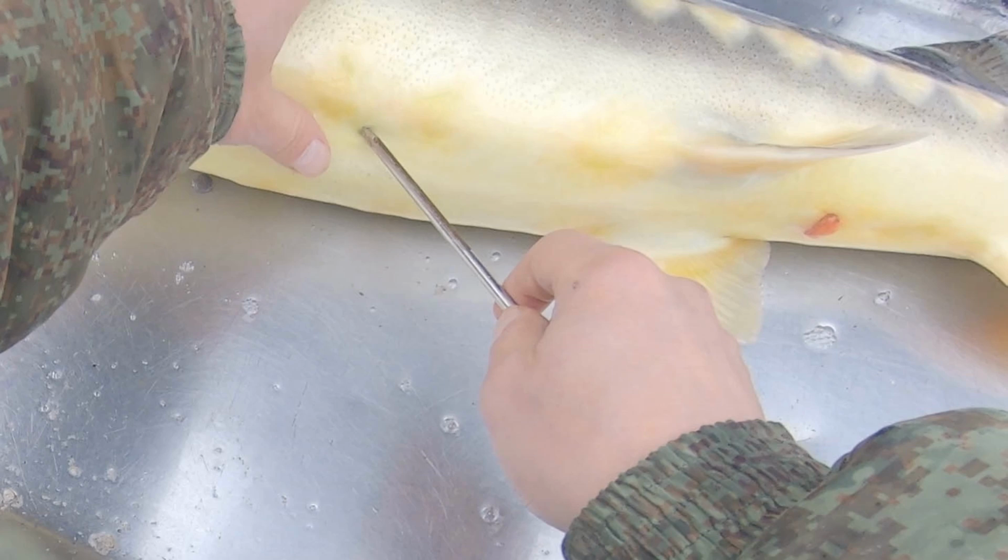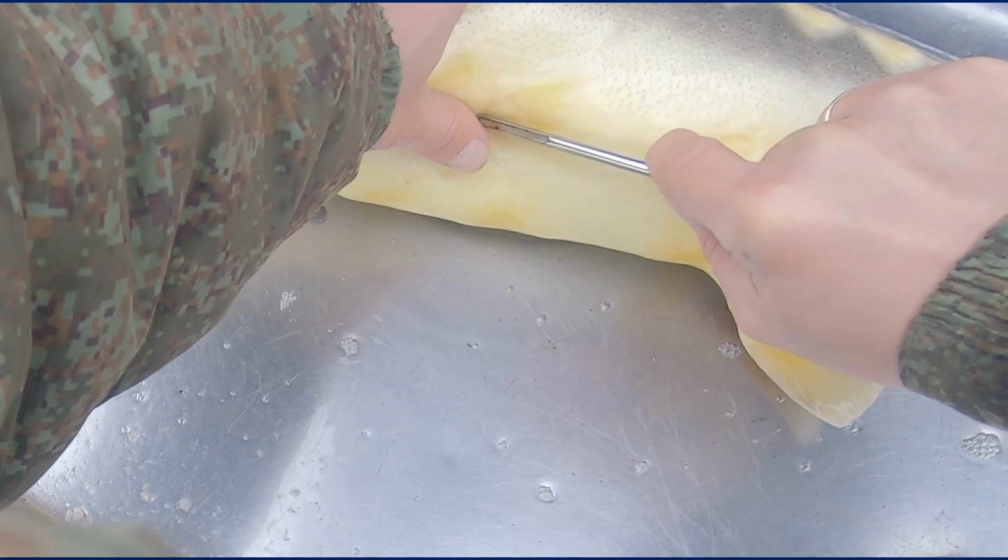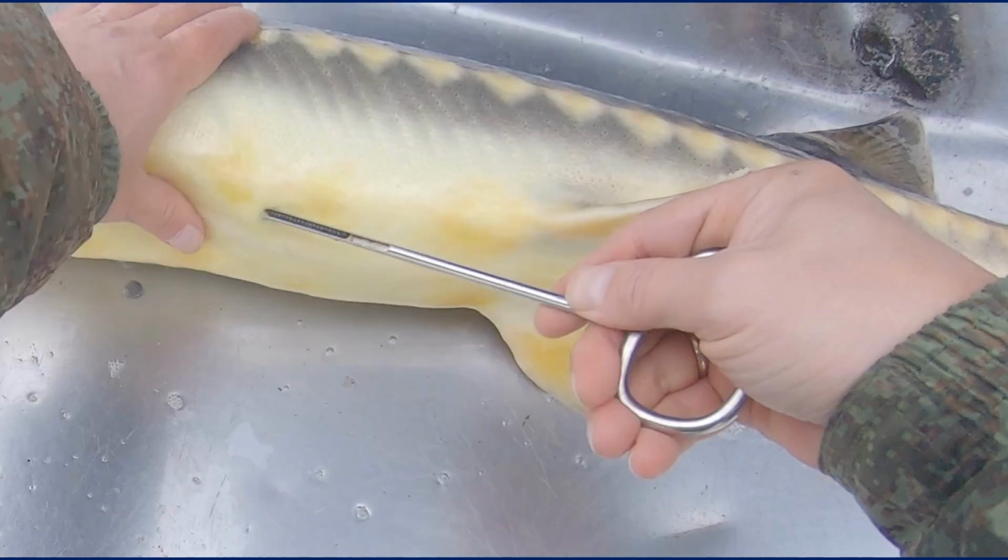First, to pass through the peritoneum, the probe is inserted at almost right angles to the abdomen of the fish. Then change the inclination of the probe to close to parallel to the body surface. Guide it along the body with a slight inclination towards the back, and smoothly lead the probe towards the head until the slit is completely inside the body. Then stop the forward movement, make one complete turn of the probe around its axis in order to capture the eggs, and then carefully extract it from the fish.